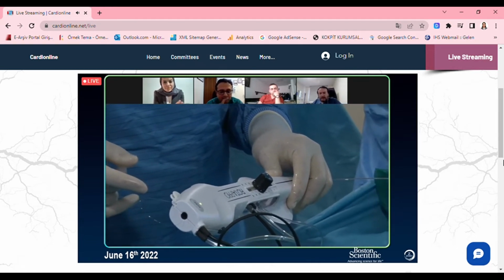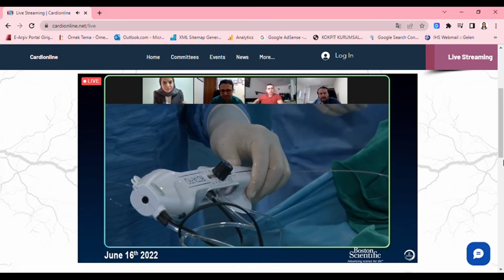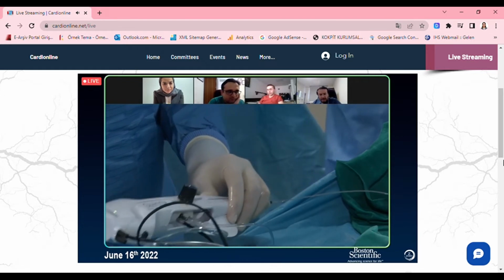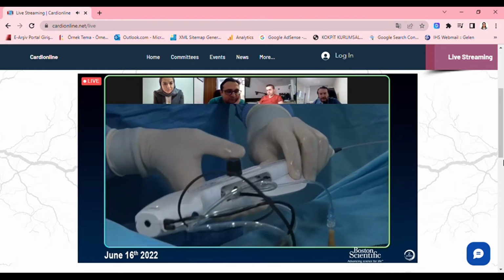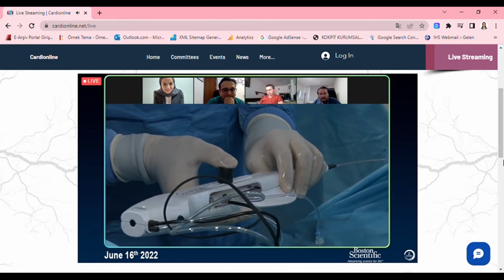All right, that's what you mean. It depends a bit. Also, we keep the brake unlocked while advancing the burr. That's an important issue. So we are in the Dynaglide and insert. Go ahead.